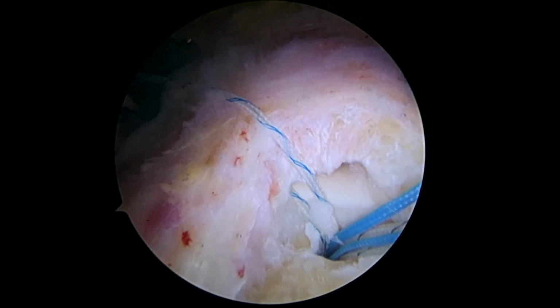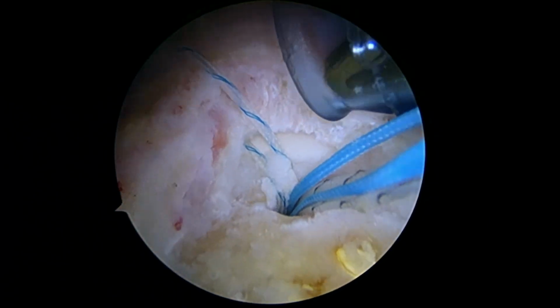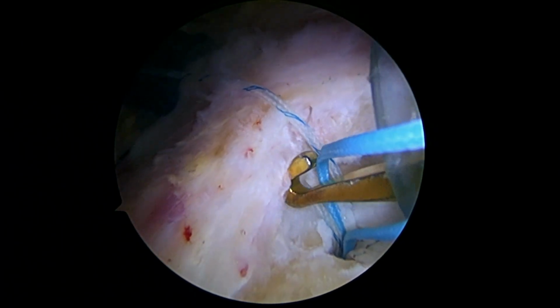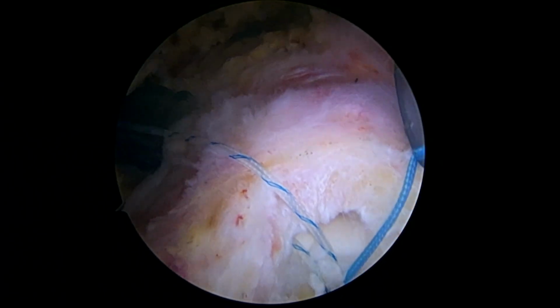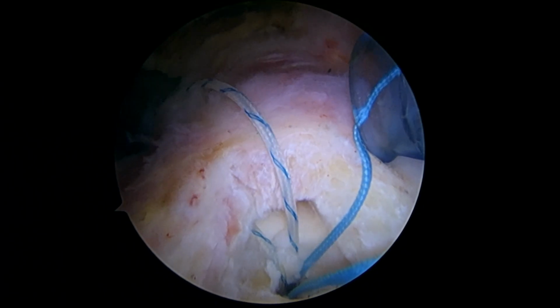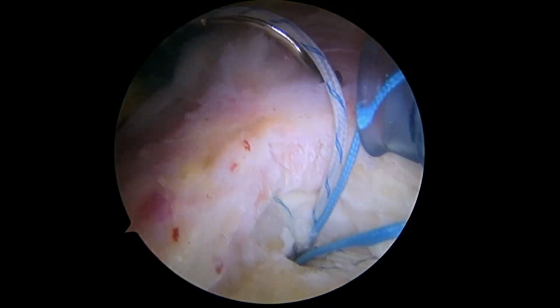So the next step, we're going to keep using that cannula on the left to pass the suture, which means I'm going to take the next suture out the front again. Here we go. Now this one's a solid blue. You can see why they're three different colors. So next, we'll take the turn to the right suture hook. Okay, pull back a little bit. Yep, great. On the camera here.